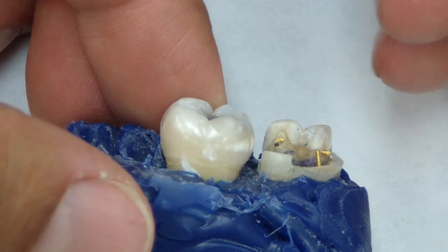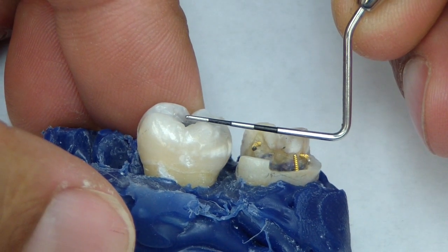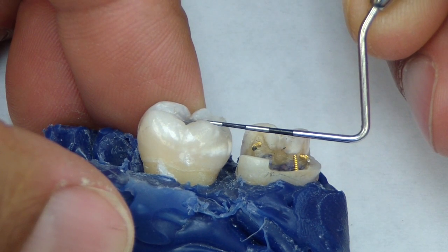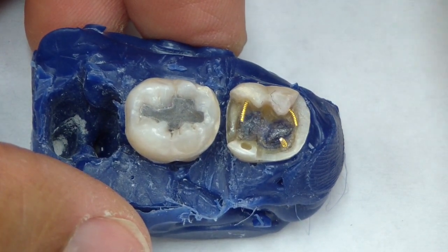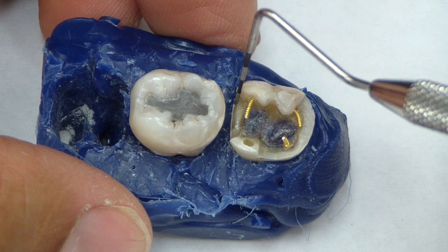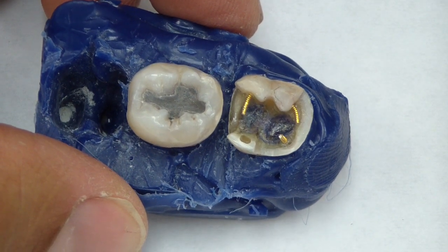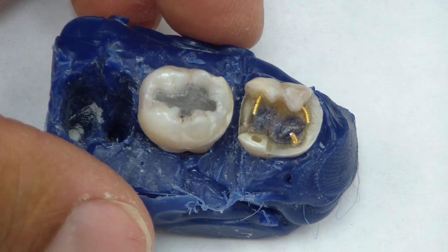And then restoring back to ensuring you have the correct amount of reduction — not only for your cusps that you've shoed, but also your pin placement. So again, this is just a complex amalgam restoration. We're going to start now filling it, using some of the tips and hints I've learned from mentors and other residents. Stay tuned. Cheers.